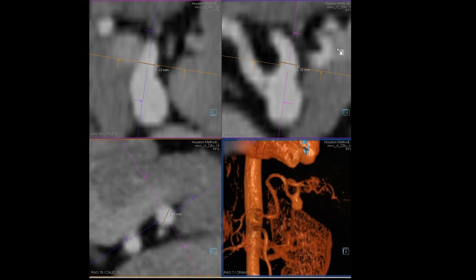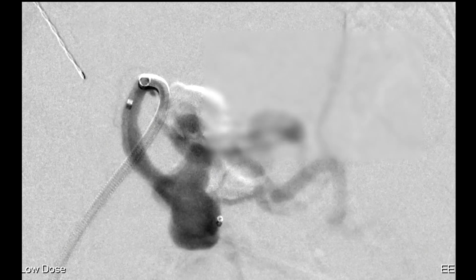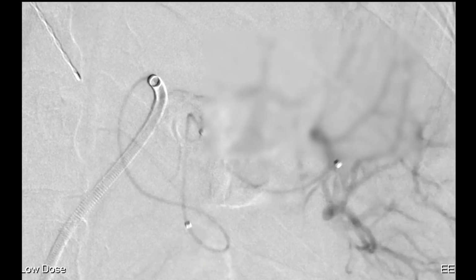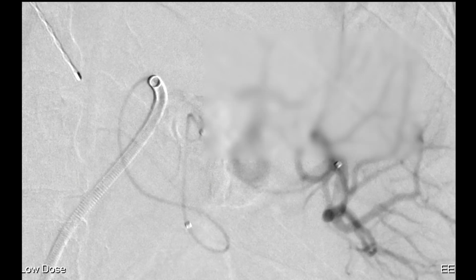As an example of a splenic artery aneurysm, you can see it's a saccular aneurysm looked at in multiplanar reconstruction. The patient was having some left upper quadrant pain. It only measured 2.5 centimeters. We opted to go ahead and treat it. And the initial plan was to actually treat it with a Viabahn stent graft. That's always a challenge when it's extraordinarily tortuous.